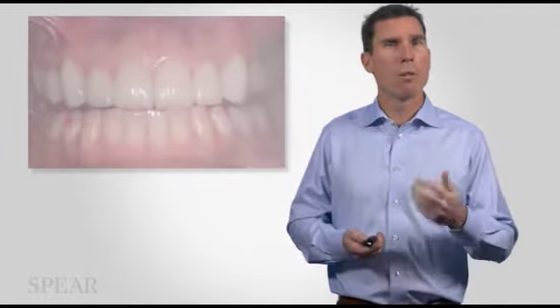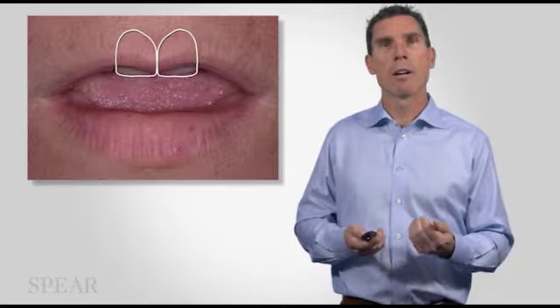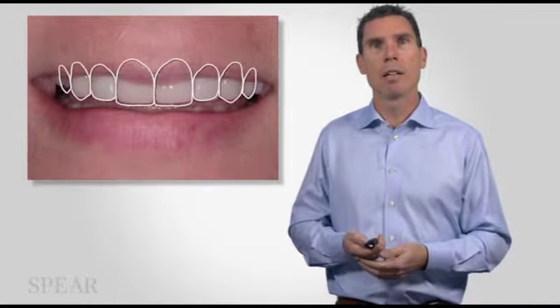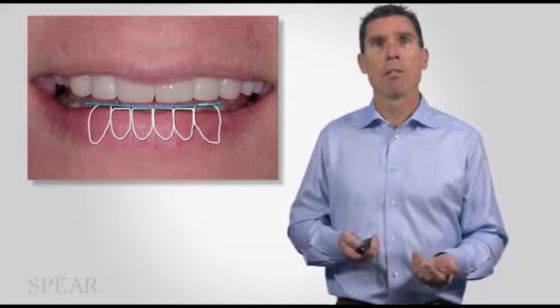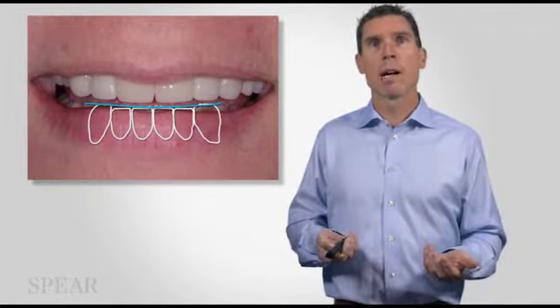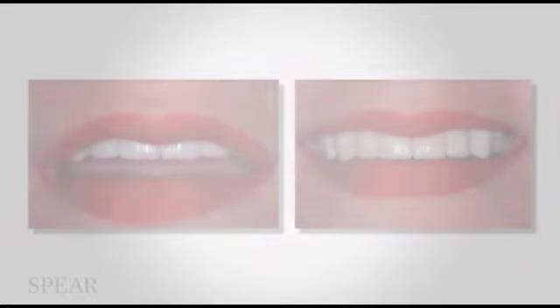And so we just started from aesthetics. We looked at where her teeth were in her head, right? We put some edges there, looked how they looked in her smile, decided where we wanted lower teeth, and then we shouldn't be surprised where we end up. We can have a fun day where maybe she wears a little bit of lipstick and comes in, lip at rest. Look at what happens with that little bit of lip support. There's no surprise. We did it with our provisionals and we did it with some intention. Full smile, everything follows her lower lip great.